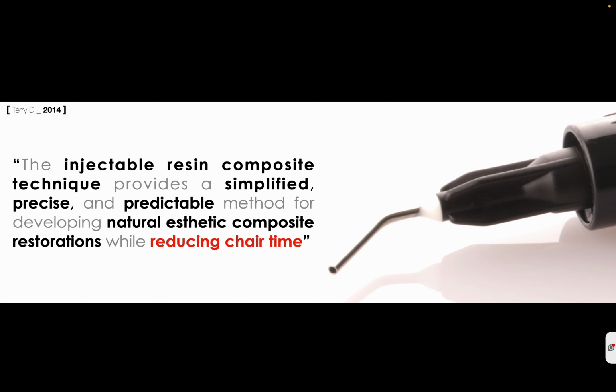But the main purpose of Douglas Terry and Powers was to present a technique that can simplify the process. You know that doing a freehand restoration can be very complex and also very skill dependent.